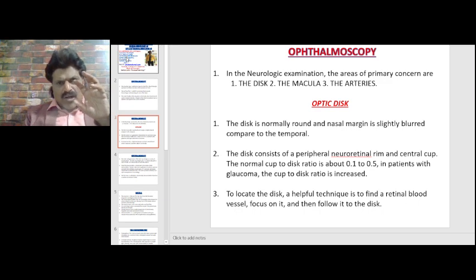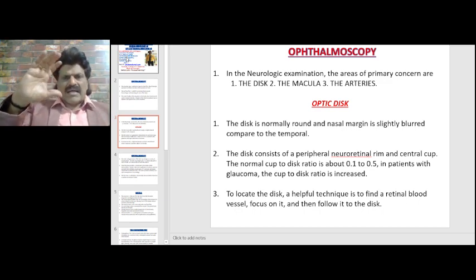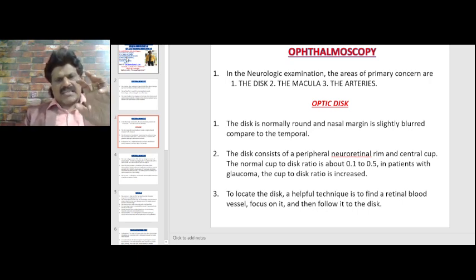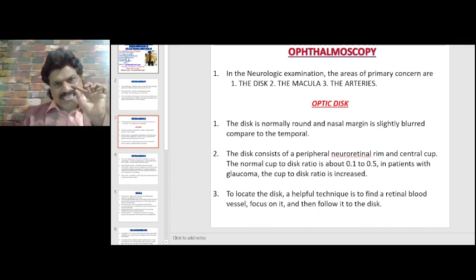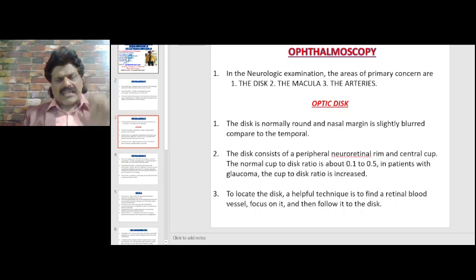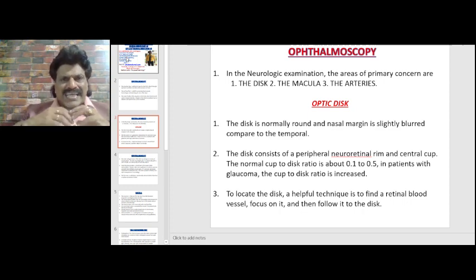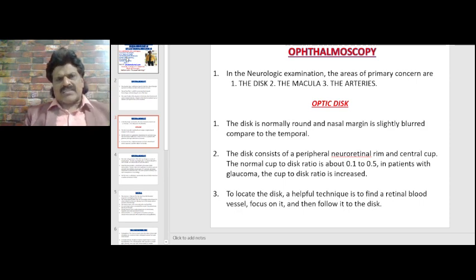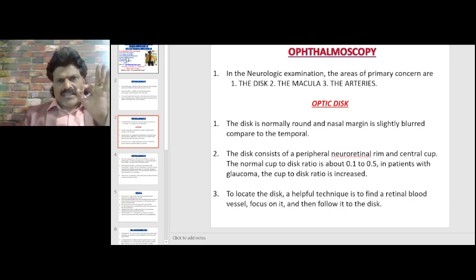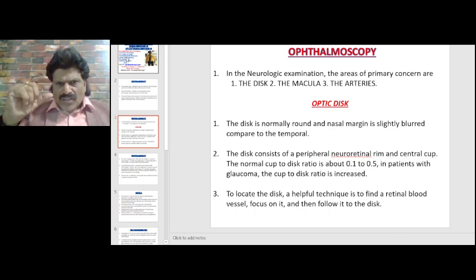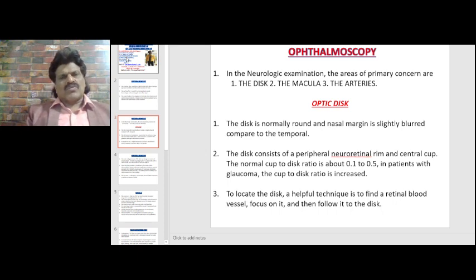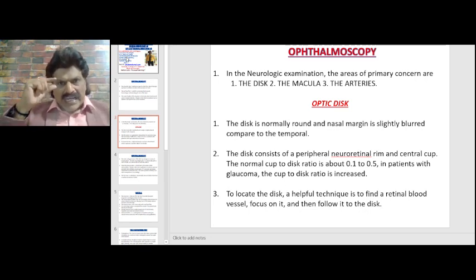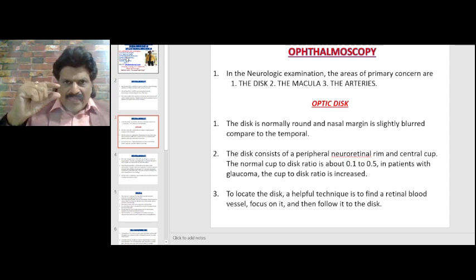The disc is normally round and the nasal margin is slightly blurred compared to the temporal margin. The disc consists of a peripheral neuro-retinal rim and a central cup. The normal cup-to-disc ratio is about 0.1 to 0.5. In patients with glaucoma, the cup-to-disc ratio is increased. To locate the disc, a helpful technique is to find a retinal blood vessel, focus on it, and then follow it to the disc.